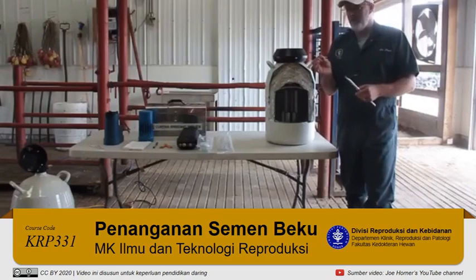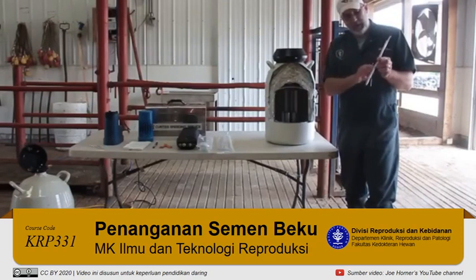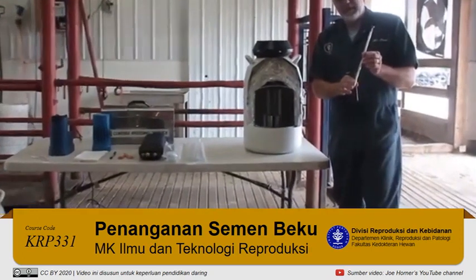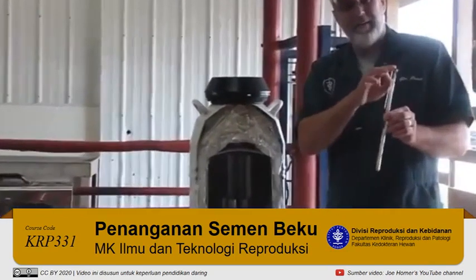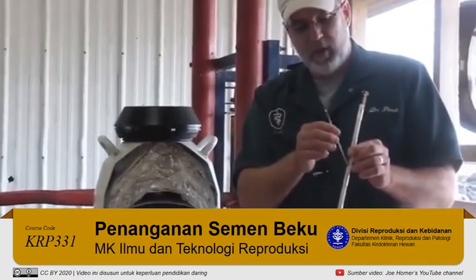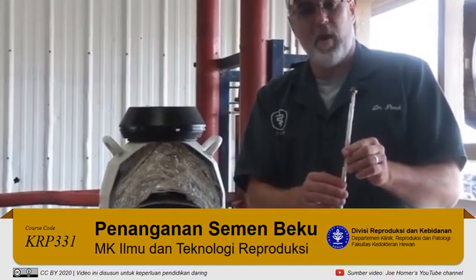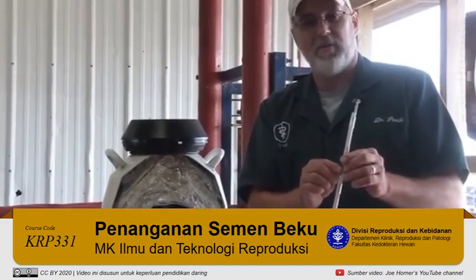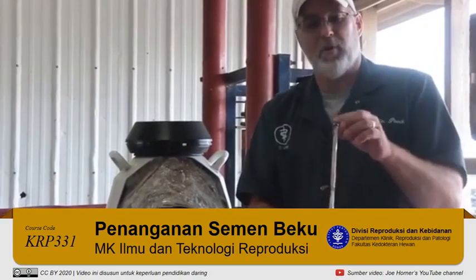His whole code number is 237AR 1149. Each straw is a half cc and goes into what is called a goblet. There are two goblets on a cane. The straw goes into a goblet — typically with half cc straws, there are five straws per goblet and two goblets, so ten straws per cane.